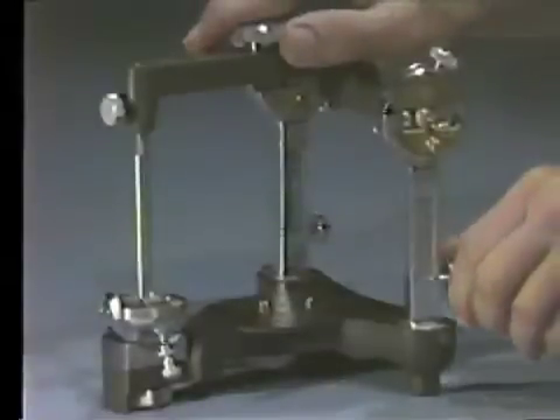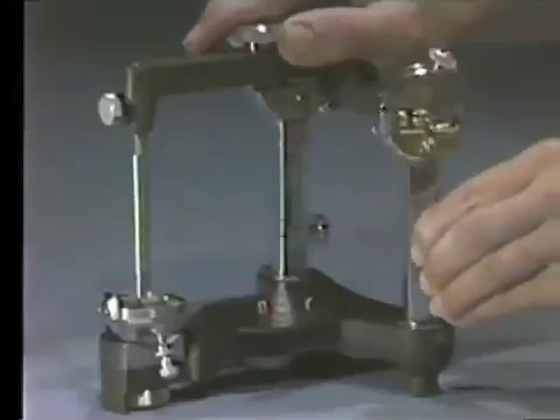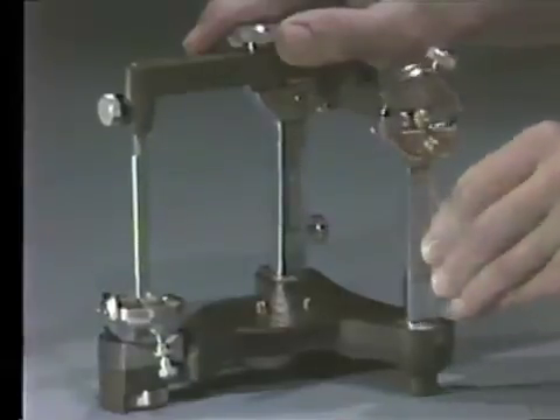Next, unlock the thumb screw on the condylar posts. Rotate the posts back and forth to check if they move freely. Set the scribe line at zero and tighten the thumb nut.